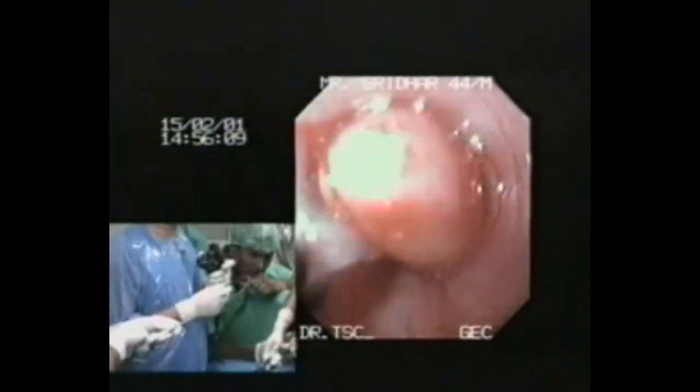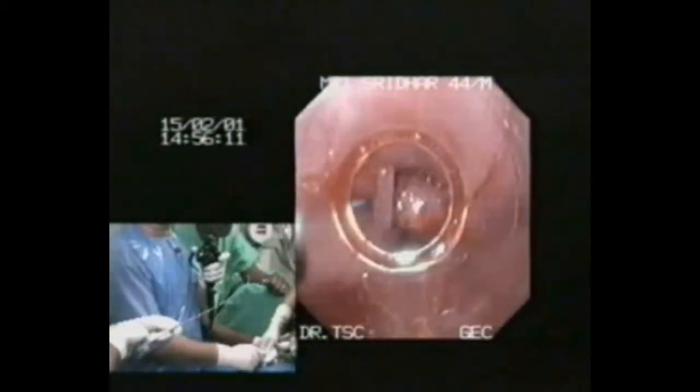The inner cylinder is placed over the varix and gently the varix is sucked into the inner cylinder till a red out is seen, and now the endo loop is deployed to isolate.